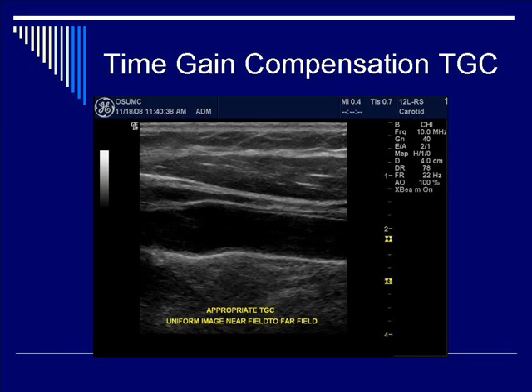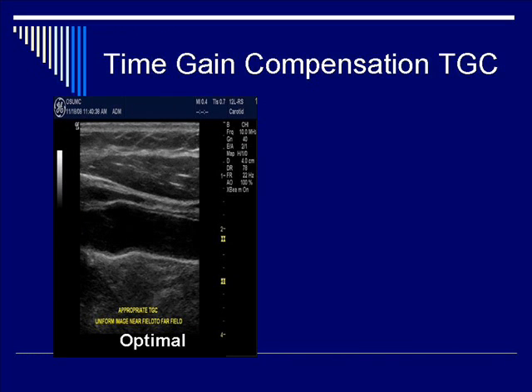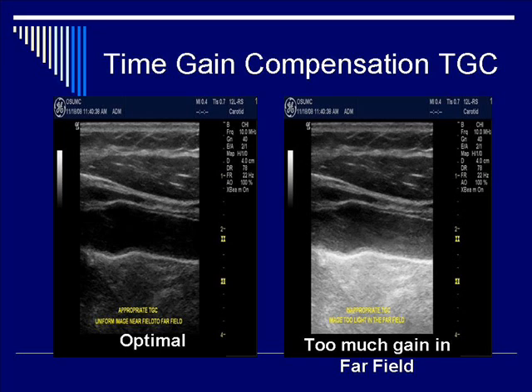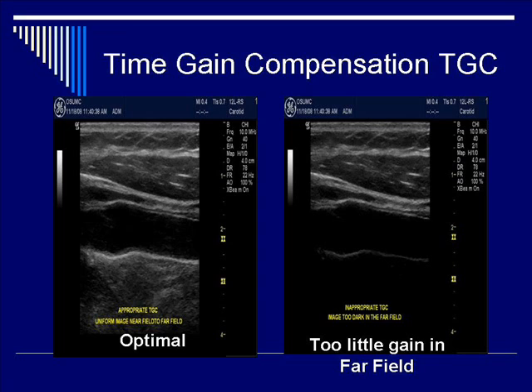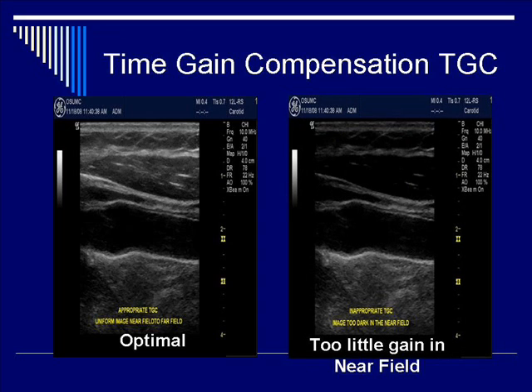Here is an ultrasound image of an appropriately adjusted surface vessel — it is optimal. Now let's show some non-optimized TGC images. On the left side is optimal. On the right side, there is too much gain in the far field, so the gain was turned up too much at higher depths. On the other side, there is too little gain in the far field — you need to bump that up. In the near field, there is too much gain, so you need to turn that down. Finally, you can have a case of too little gain in the near field, requiring you to turn up the slider bar at shallower depths.